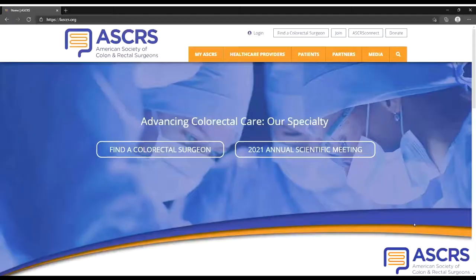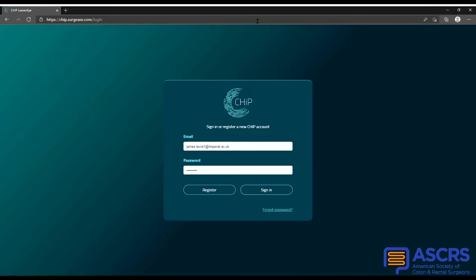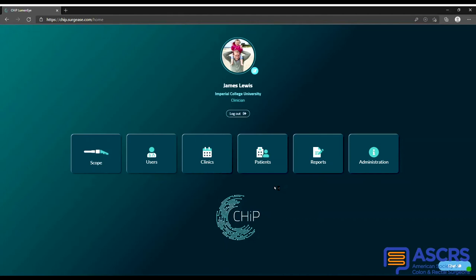The CHIP platform is a web-based secure encrypted service. Institutions have unique work environments and are responsible for issuing user accounts. The home page allows quick access to scoping, user management, clinic management, patient management, and reports.